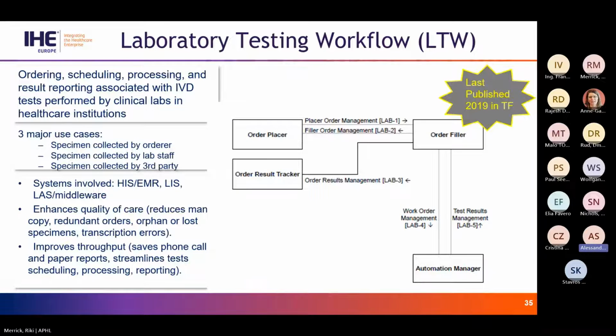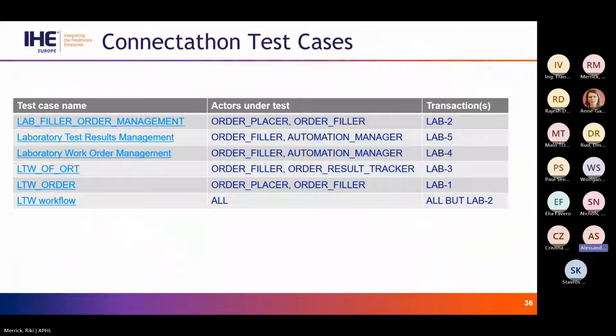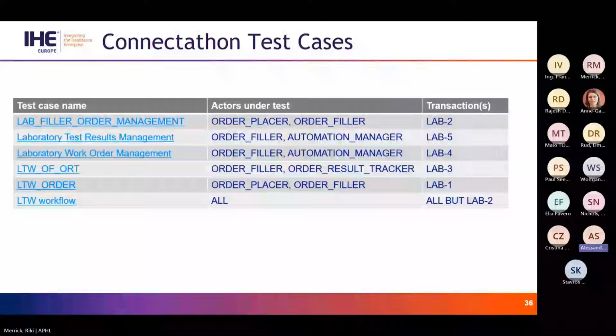So also for this profile, we have several test cases. These test cases, as they are in production, are already in Gazelle. So if you look inside Gazelle, in the overall test list for the connectathon, under PaLM and under the laboratory testing workflow profile, you will find this list of tests that are related to specific transactions and specific use cases to test.